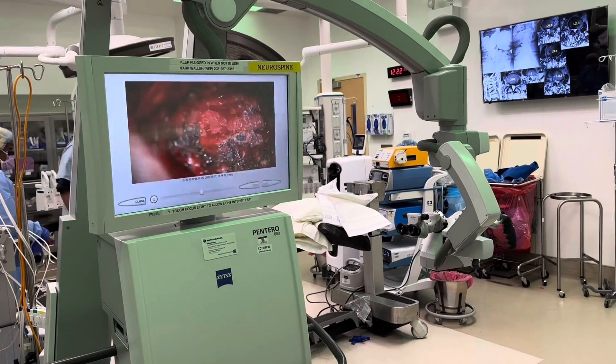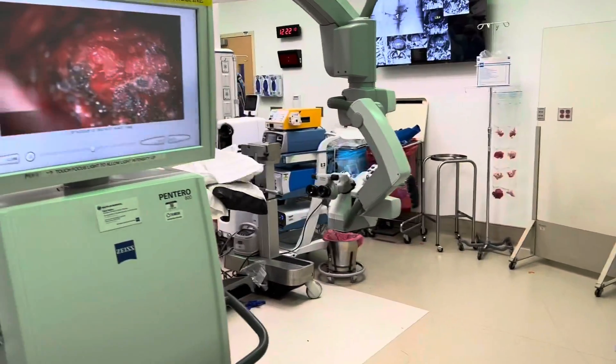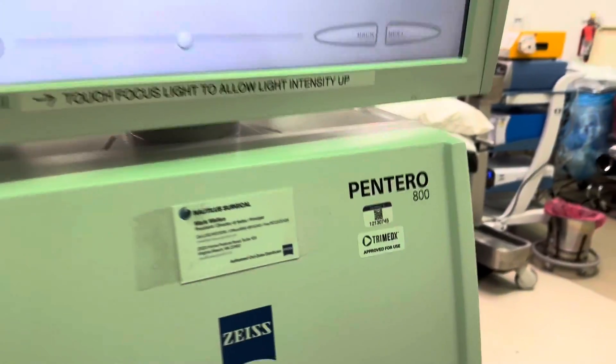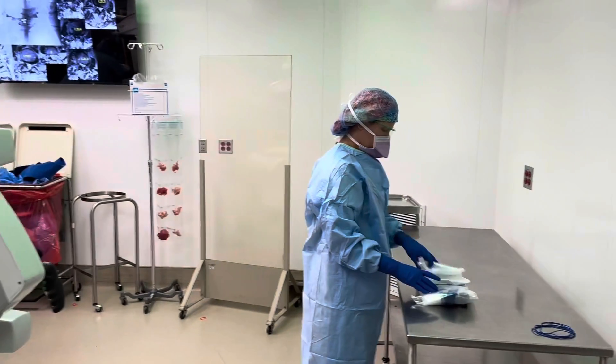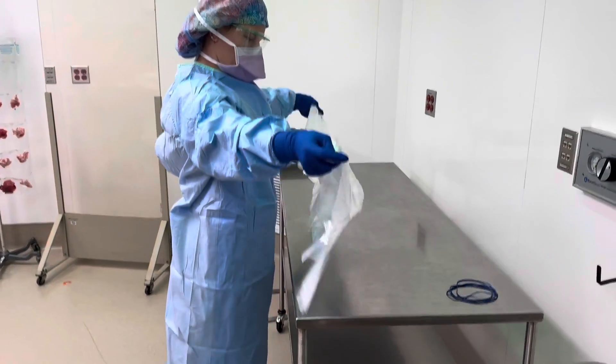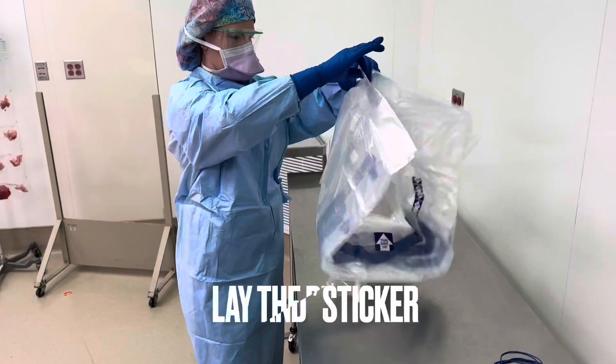This will be a video explaining how to drape the microscope. The microscope I'm talking about is the Pentero 800, and Kristin is going to show us how to do it.